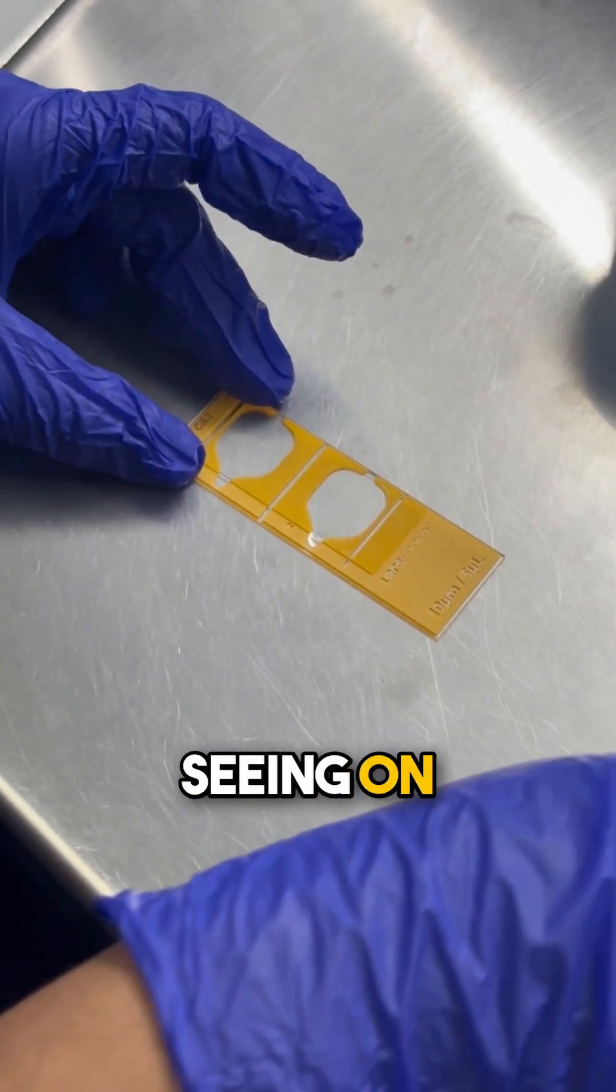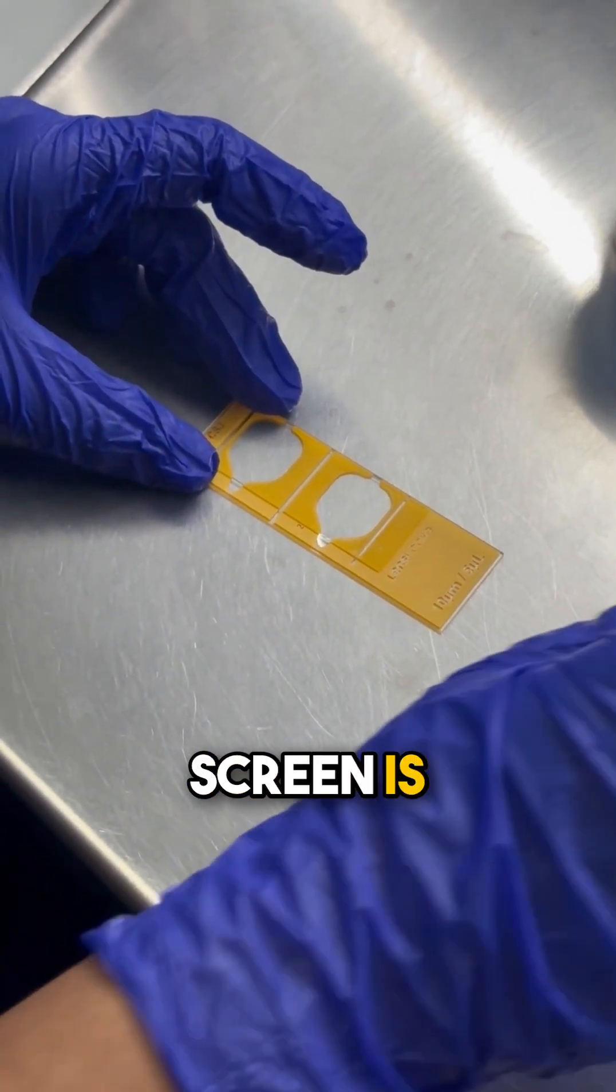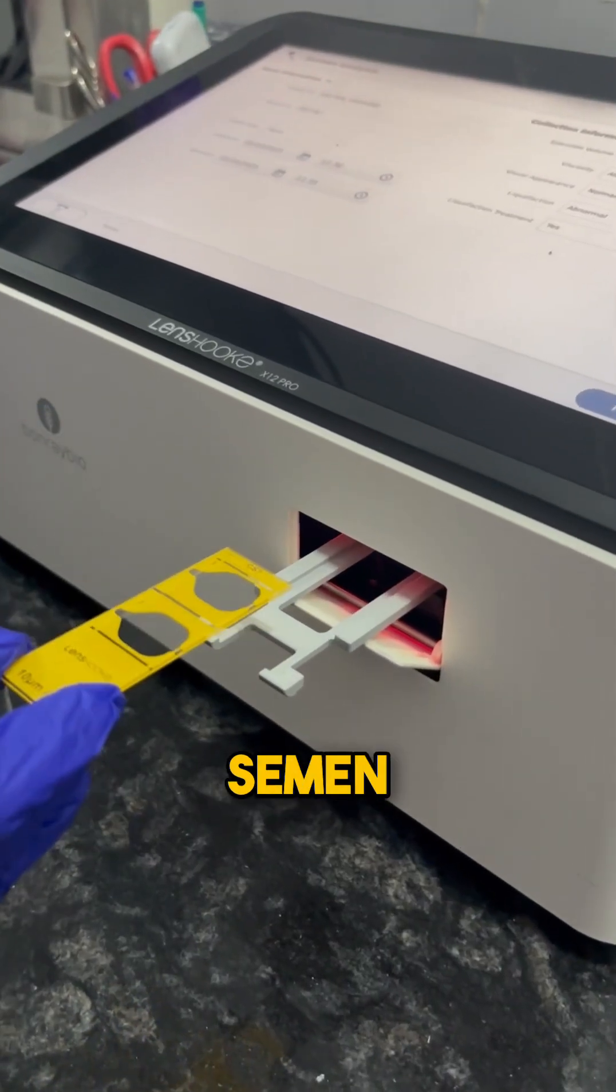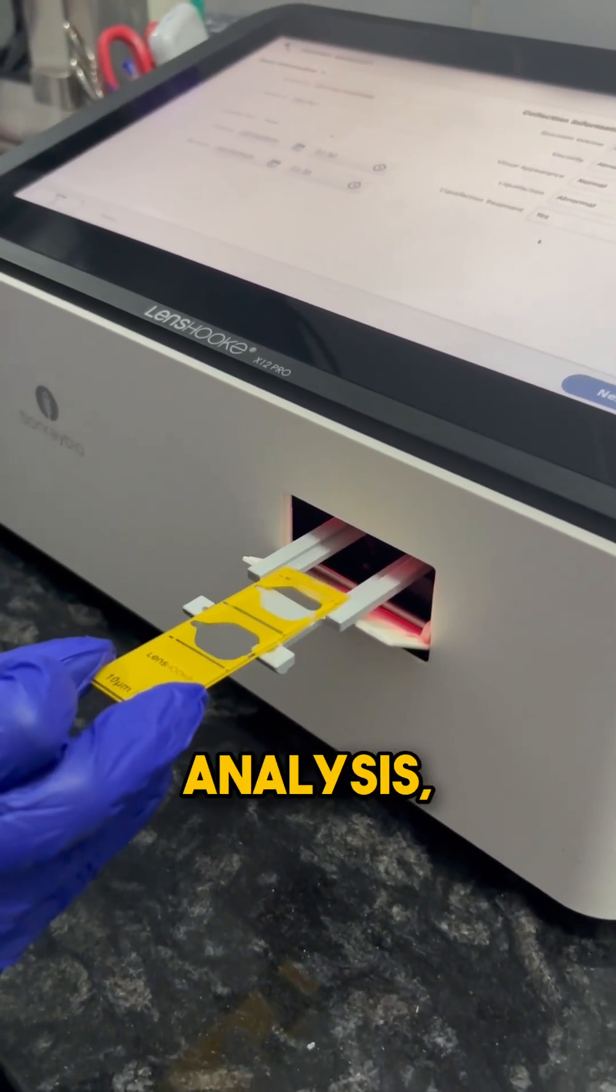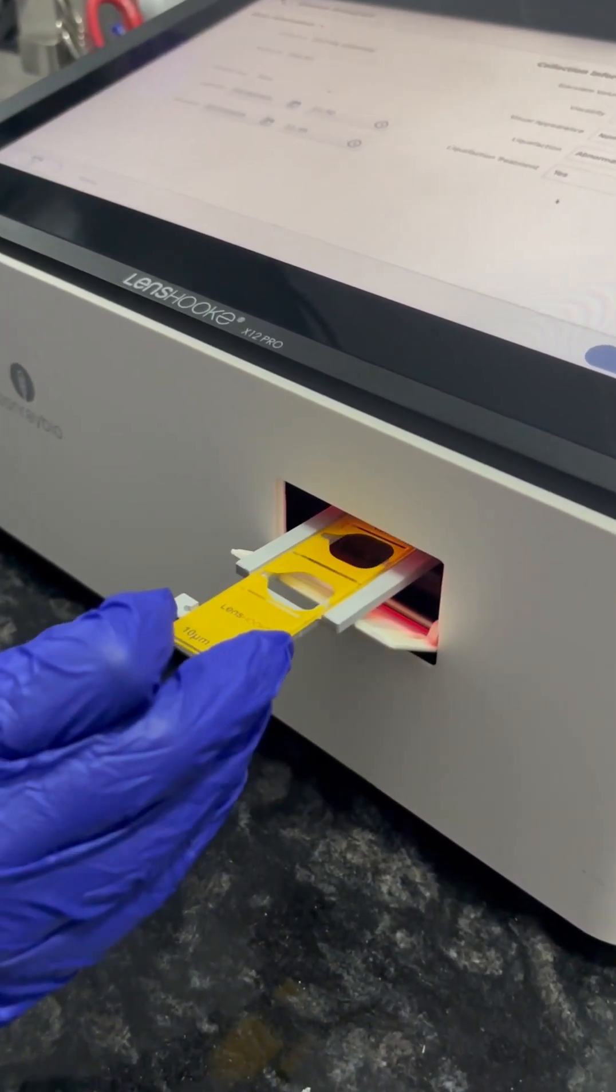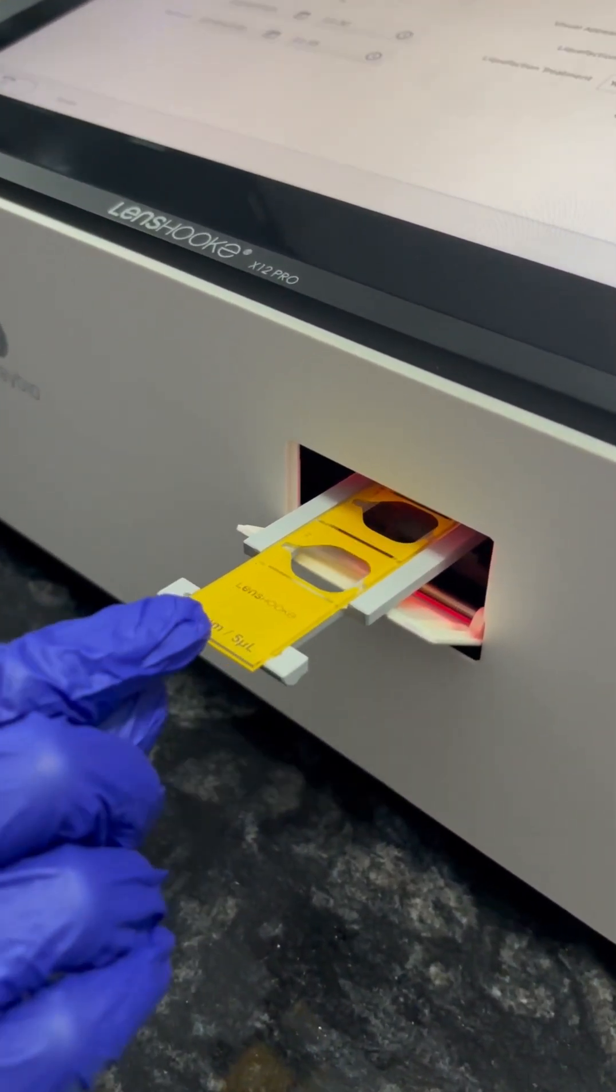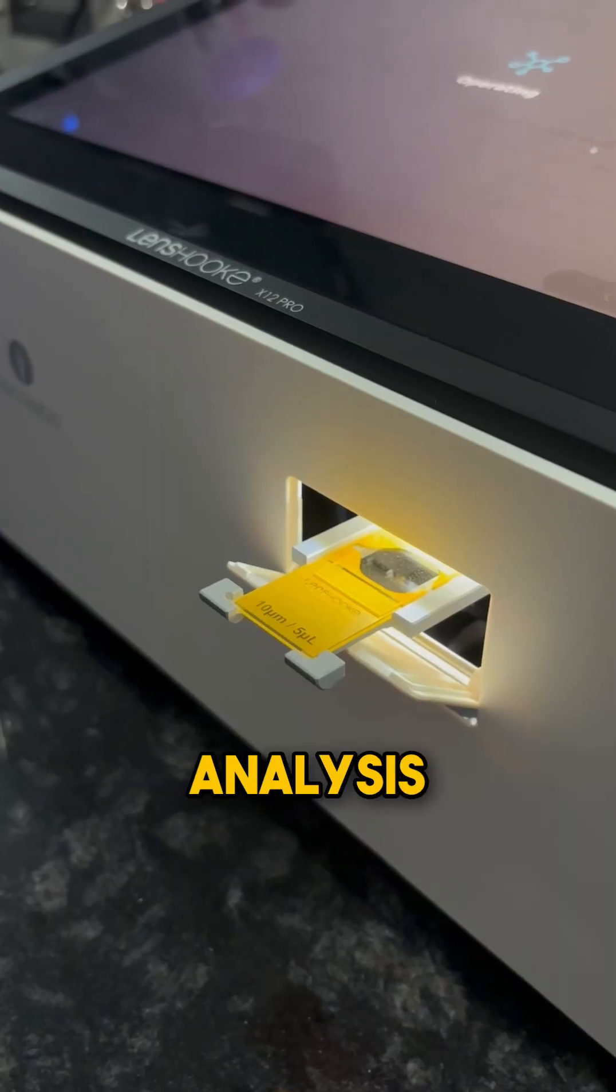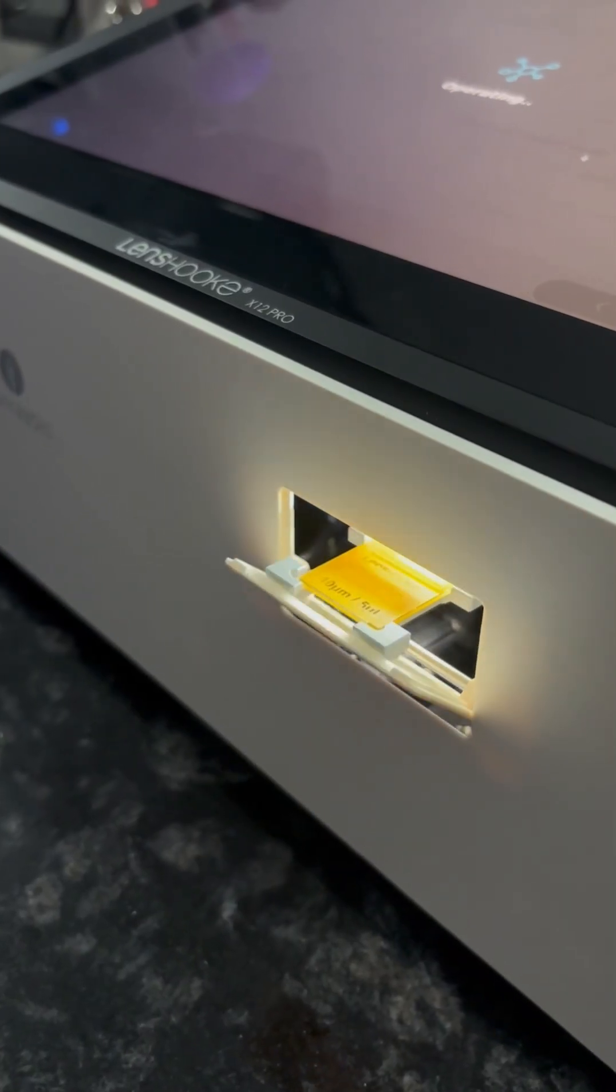What you are seeing on screen is computer assisted semen analysis, which is right now the most advanced semen analysis technology.